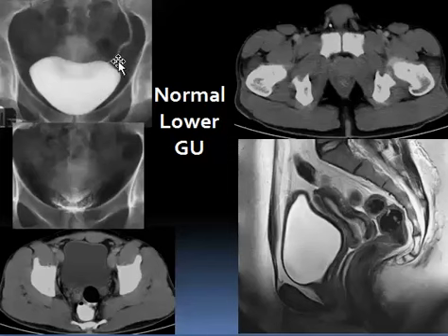This is the insertion of the ureter at what we call the vesico-ureteric junction, and here is the region of the interureteric ridge, and here again is the region of the interureteric ridge as the bladder is going down. As you see, some urine is accumulating above the interureteric ridge posteriorly.